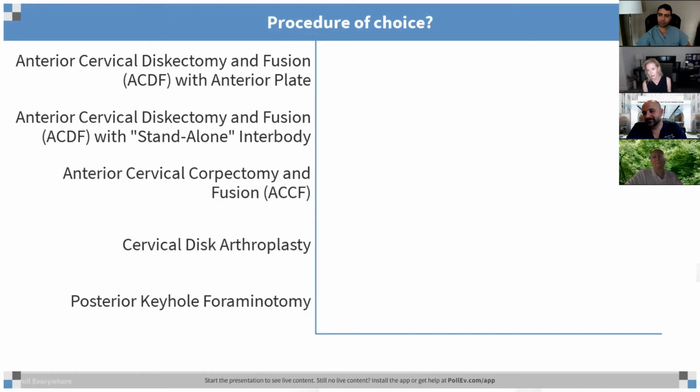And if you look at the best arthroplasty devices in use, to your point, probably hips and shoulders, what will every orthopedic surgeon counsel their patient as to how long that device will last? 20 years probably, sometimes a little more, sometimes a little less. And so, we're pretty jazzed about 10-year data. I think it's going to be really interesting to see how things shake out over the next 10, 15 years for sure. Whereas with ACDF, you have something that's really tried and true.